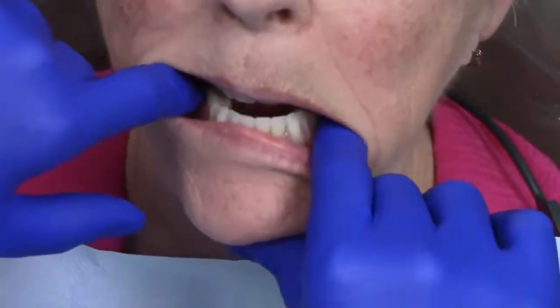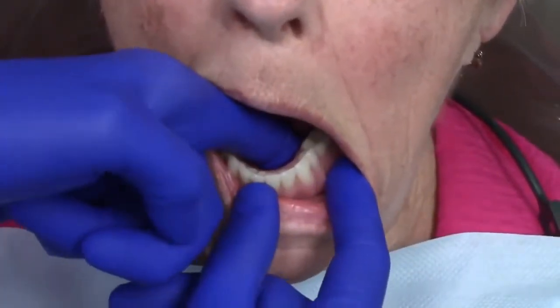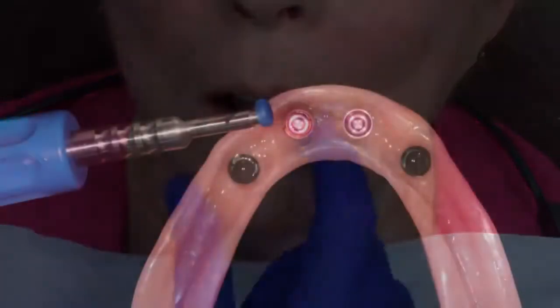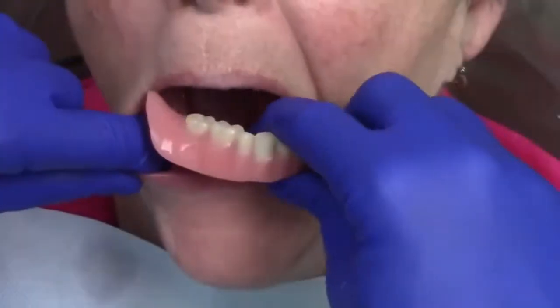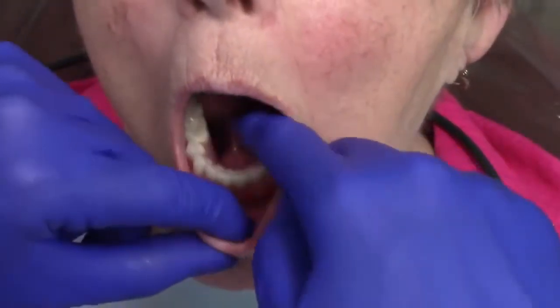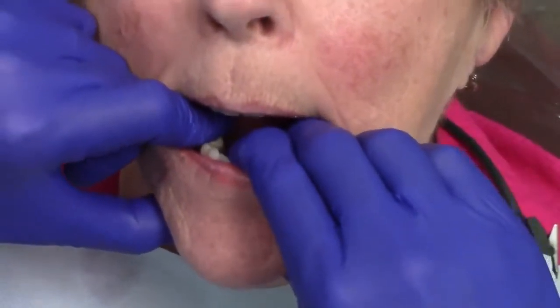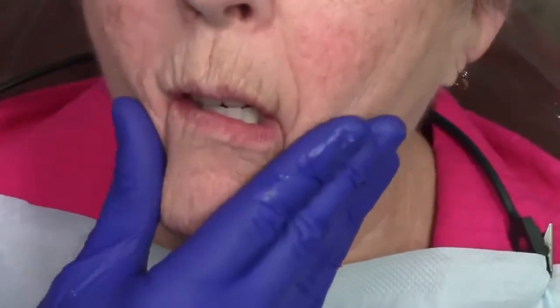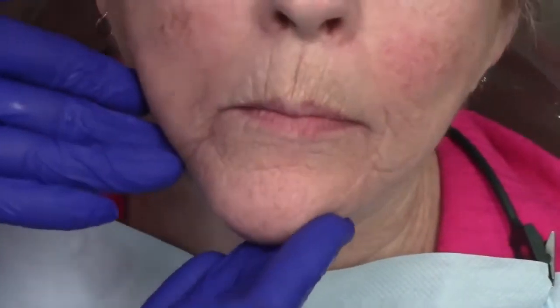This allows me to try the denture back in the mouth to ensure that I've done a proper pickup procedure before doing any fine polishing and tuning adjustments. Now that I've verified that the attachments have been picked up properly, I change the Locator RTX black processing males to the blue inserts. At this point, I know that I can put the denture back in the mouth and the patient is comfortable with the retention and stability of her prosthesis.